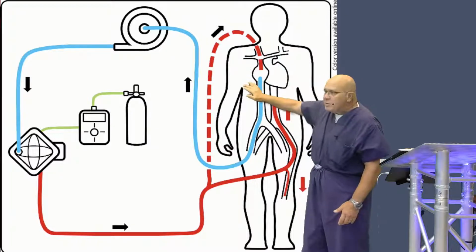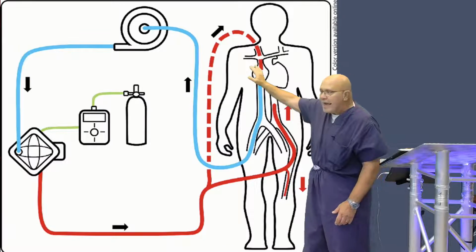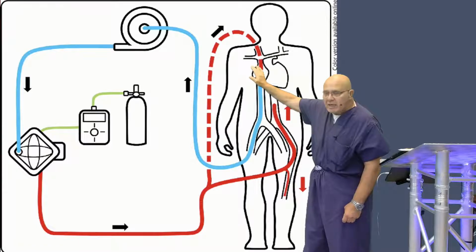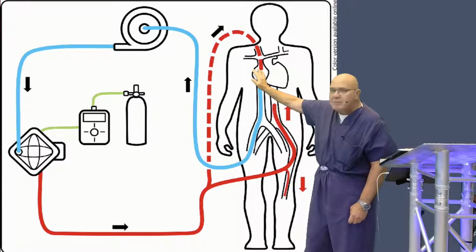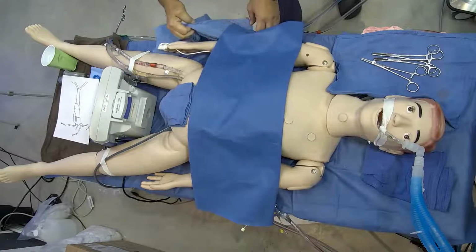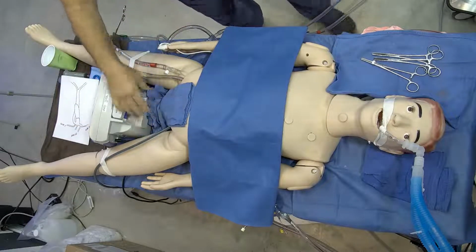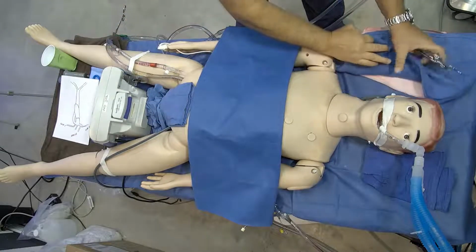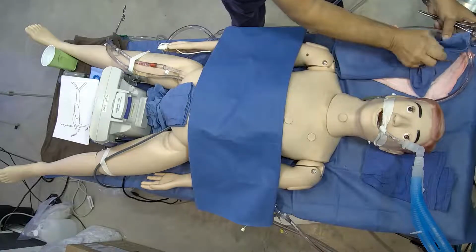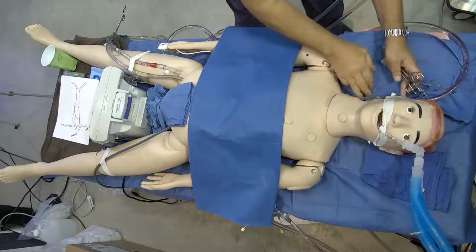So anything you can do at this point is either reducing the Impella or adding a second line. So we're going to go ahead and add a second line and take a look and see what that looks like. So let's go back to our overhead of camera 5, please. I hope you all don't mind, but I have taken the liberty of doing this already so that it wasn't something that everyone had to watch me do. There is a technique for doing it, and it does take a little bit of skill, but that's a different session for a different day.